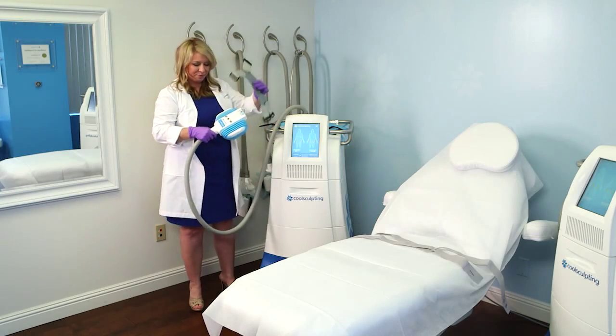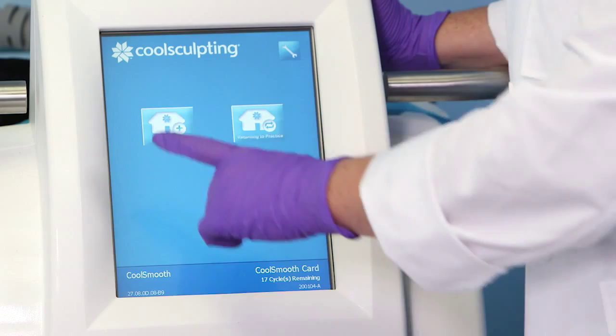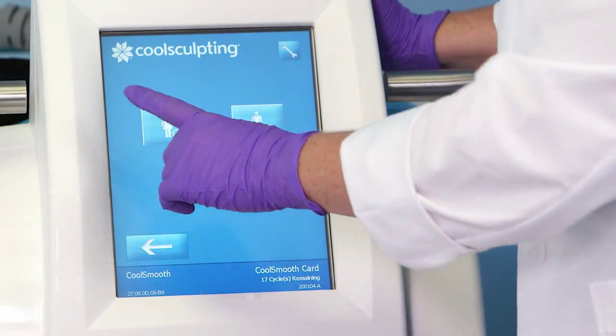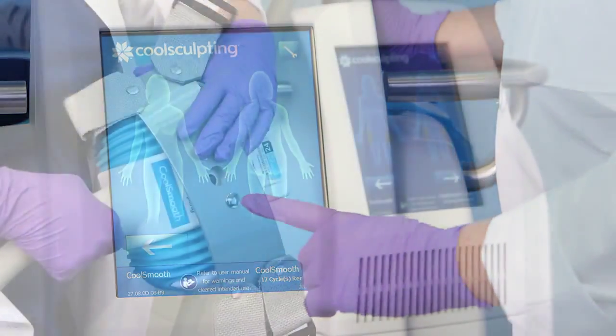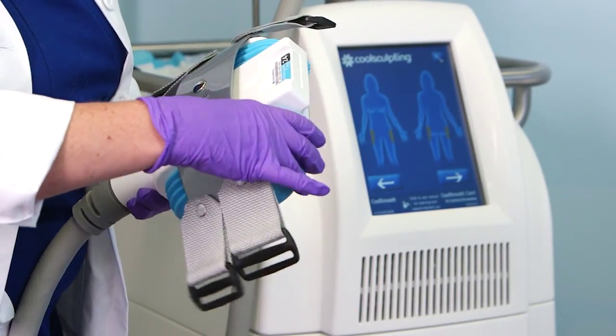Before the patient arrives, prepare the treatment room. Turn on the CoolSculpting system. Attach the CoolSmooth applicator into the system and the blue cycle card into the applicator. Next, snap the reusable securement system to the top of the CoolSmooth applicator.